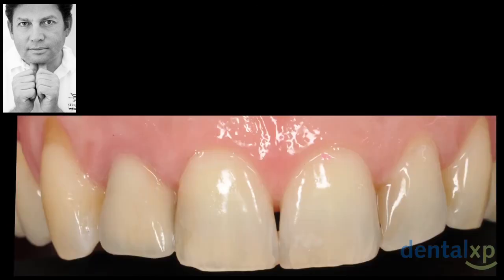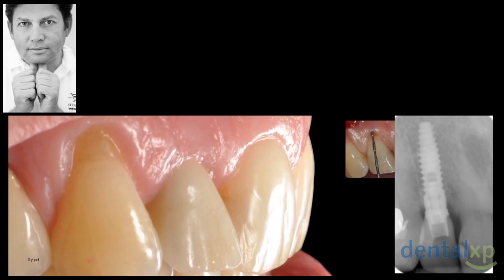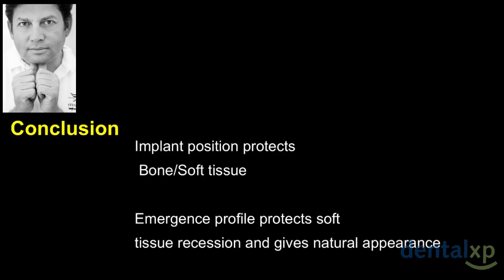implant placement cases. Now, when we look at this case, this is 6 months after delivery, and now we look at another 1.5 years. So this is very important because this helps also patients who have a very thin biotype and thin tissue. And when we look, we can see that the soft tissue came down more coronally. This was creating the housing. This is the implant in position. And we could increase the soft tissue outcome just by framing.